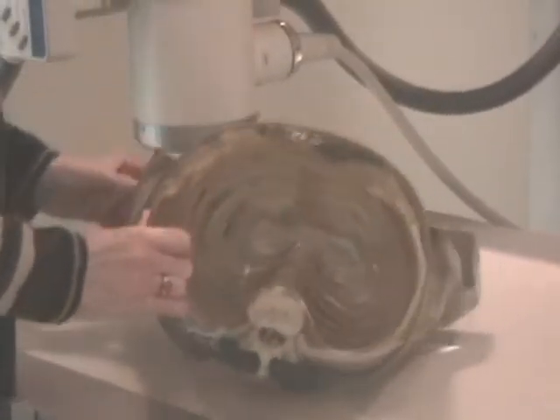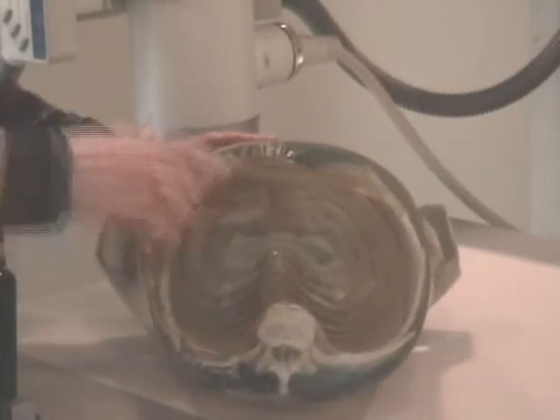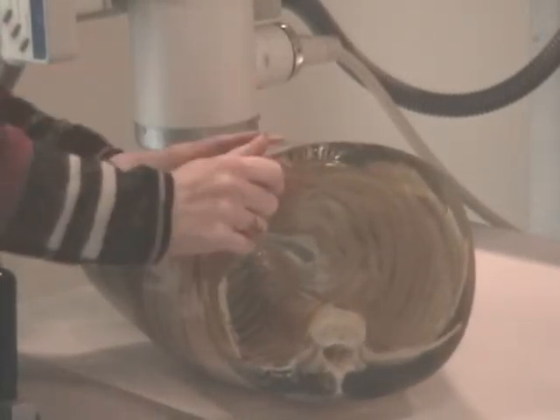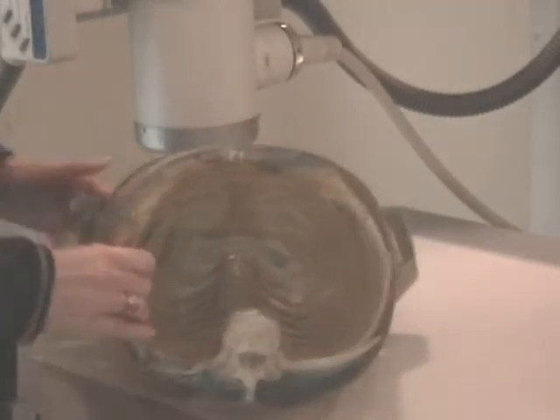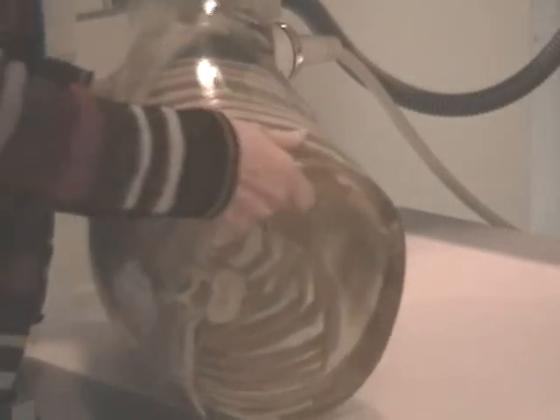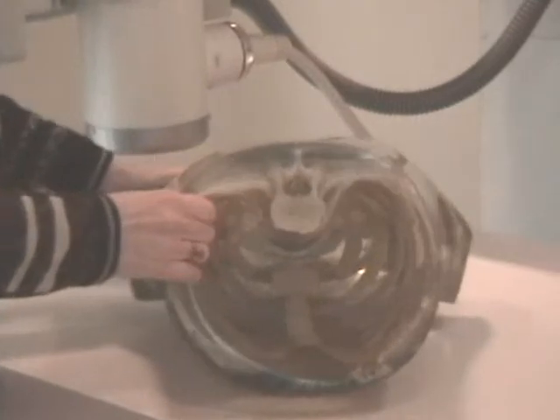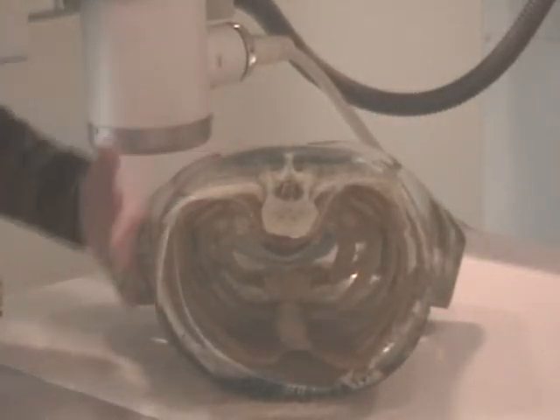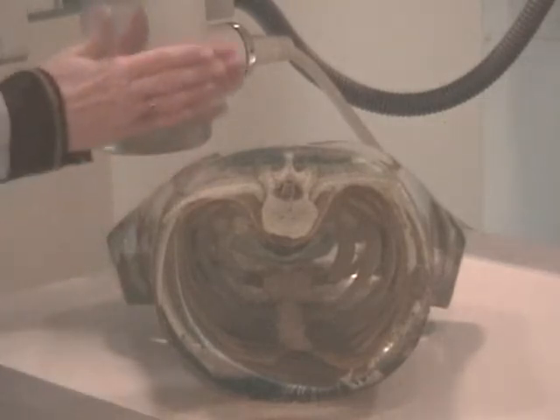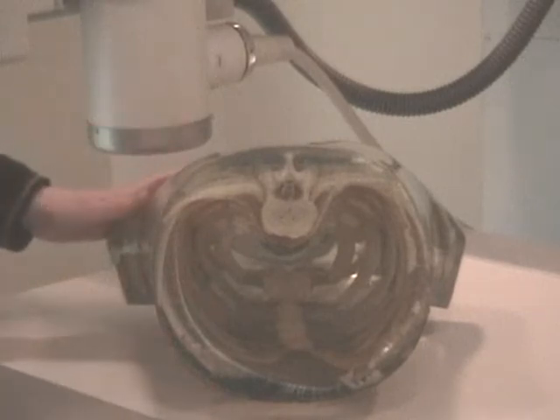Okay. Now, what happens if a patient fell forward getting into their bathtub and they hit the anterior injury, or hit the anterior side of the ribs? Well, you're going to choose to have them in a PA position. Okay? And let's set up the scenario that it's left ribs. So we'd focus on the left side. Again, we'd take a big film above diaphragm. We'd take a little film below diaphragm with the patient in a PA position.